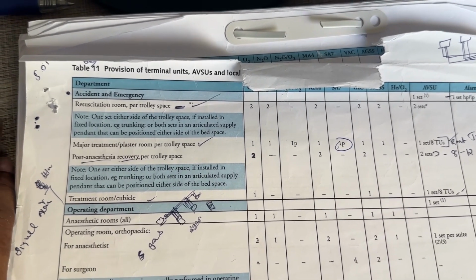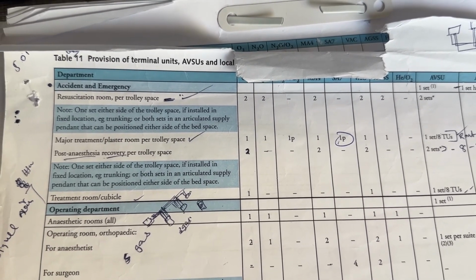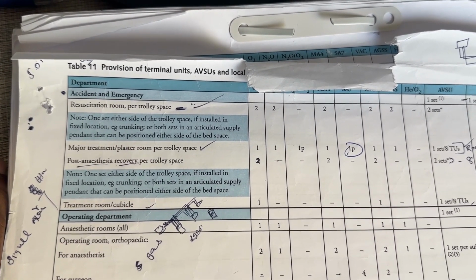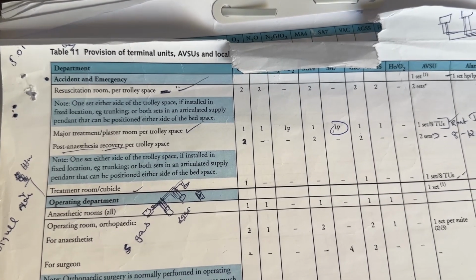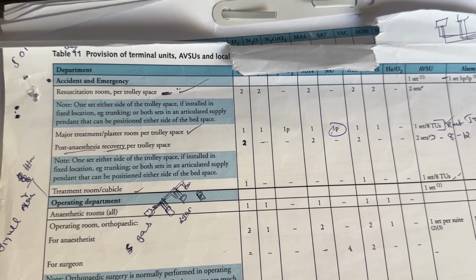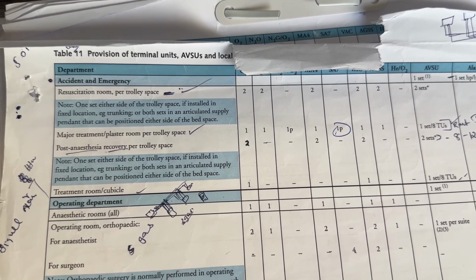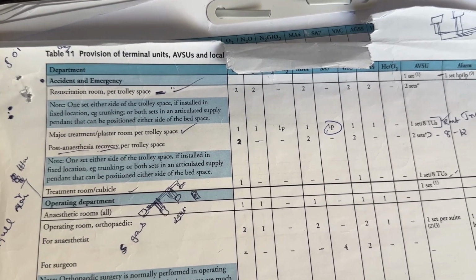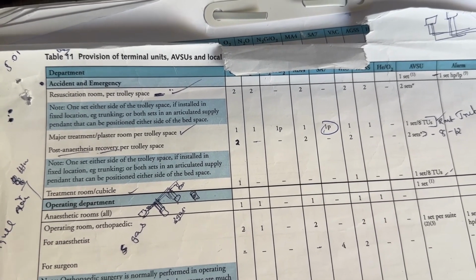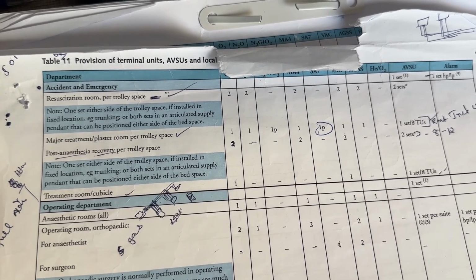It's like a mini operating room, so we need 2 sets of outlets. It could be a wall outlet, or a pendant outlet or BHU; normally the resuscitation room is BHU or pendant. If it is a BHU, we give 1 set on the left side and another on the right side, with 2 AVSU with dual circuit. Later I will show you the drawing.